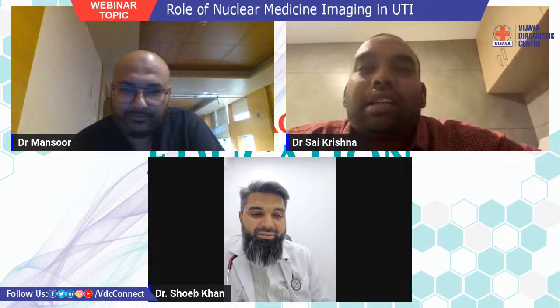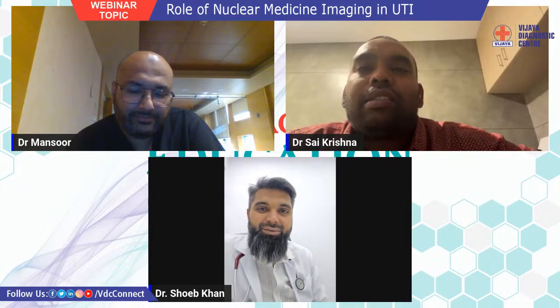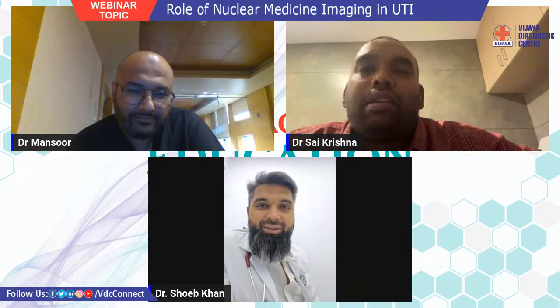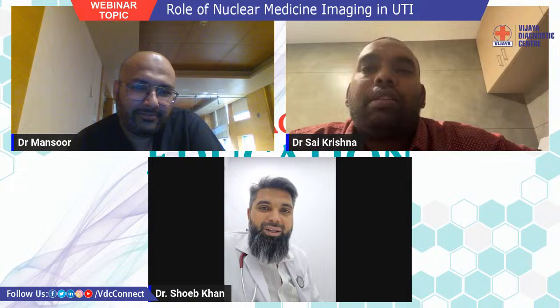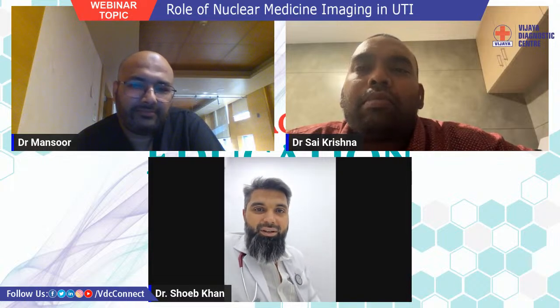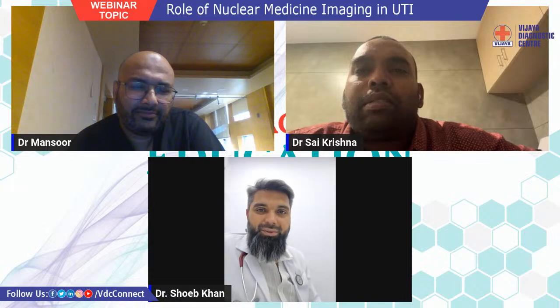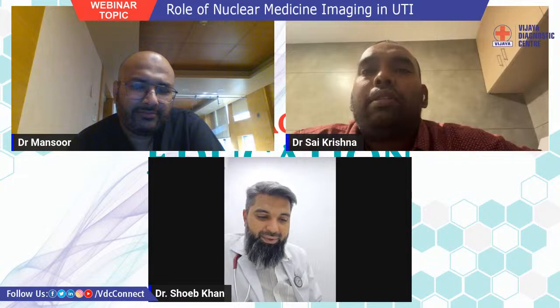Yeah, it definitely matters, because we can't differentiate low and high pressure on MCUG. The only thing we can see is the degree of reflux. High pressure, low pressure is something seen on urodynamics. If it's a high volume, high pressure bladder, then it will be posterior valve associated or secondary to any bladder outlet obstruction. So I don't think DRCG is relevant enough there to differentiate those things, as elaborated in the presentation itself.